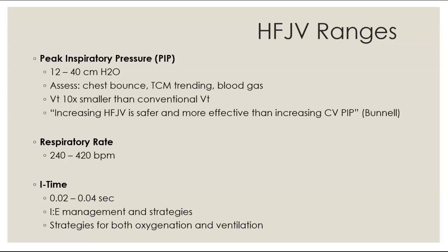Most of the time, you'll just keep it at 0.02. It's very just dire situations or strategic situations you would adjust the I time. And then even then it would be like 0.024, 0.028. Something like that you would set.